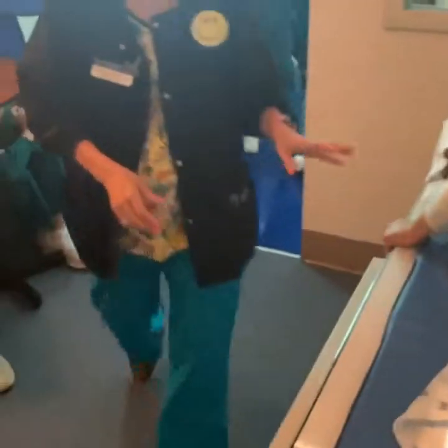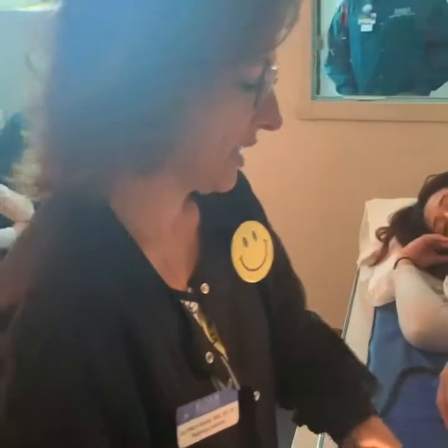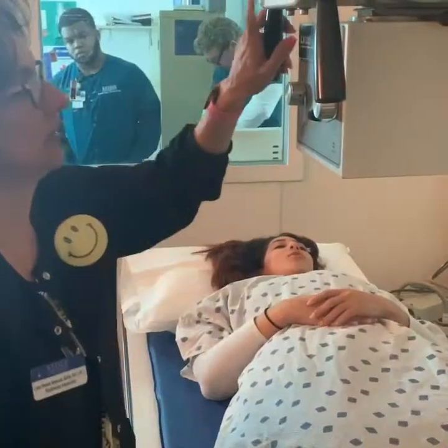So 4 views: 2 AP, AP proximal, AP distal, lateral distal, lateral proximal for a femur. All right, you can lay back. I'll go check those, and then I'll let you get dressed and you'll be all set. Okay.